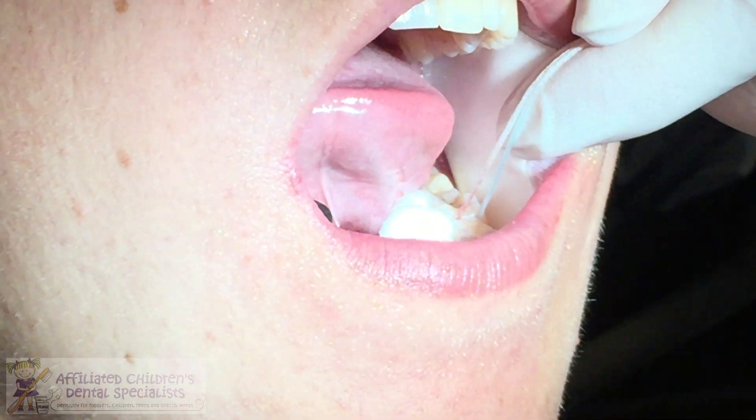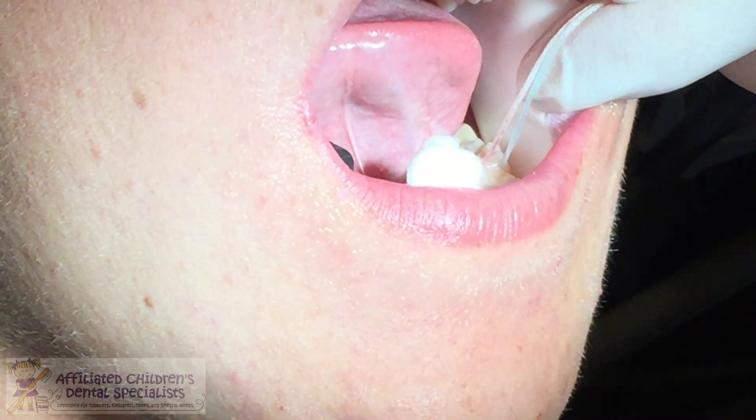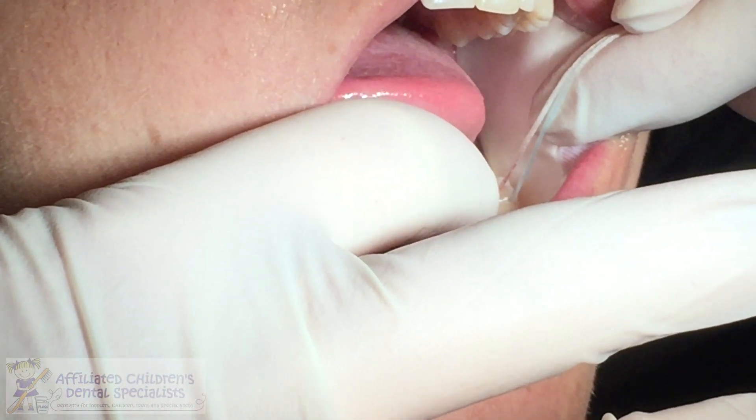Now we're going to start the timer for one minute. You doing okay? Mm-hmm. So easy — so much better than filling your tooth.